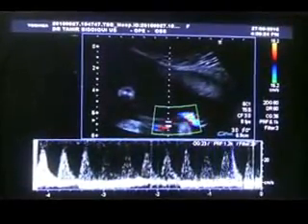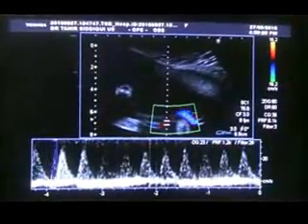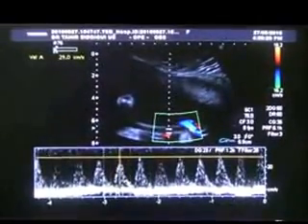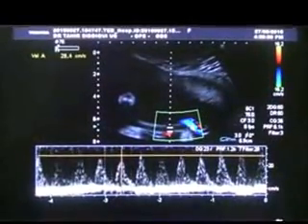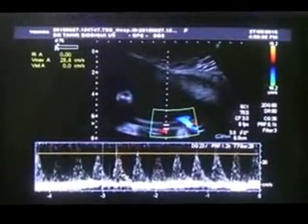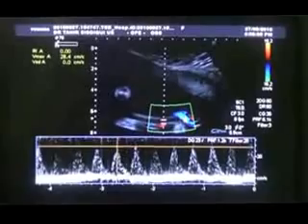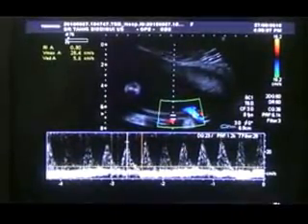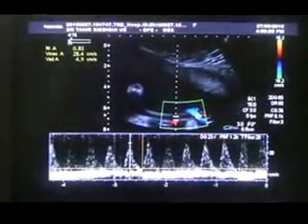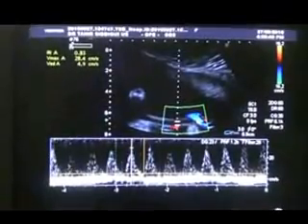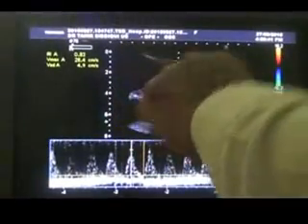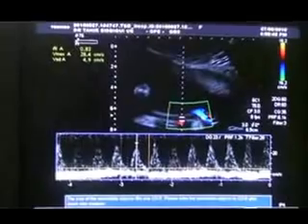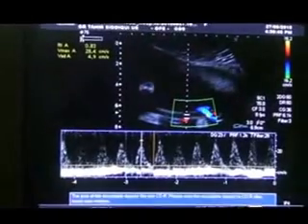The fetus is hyperactive, and it is not unusual to see a hyperactive fetus in cases of anencephaly. This is the case of anencephaly with meningomyelocele. The resistive index is 0.83 — a high resistive index — that of the umbilical artery.